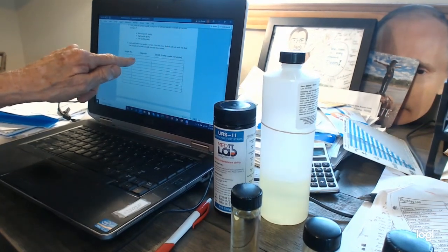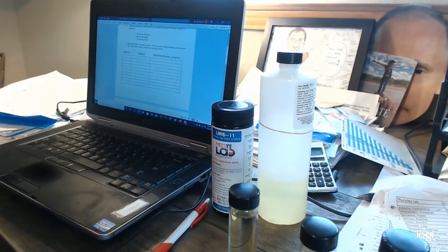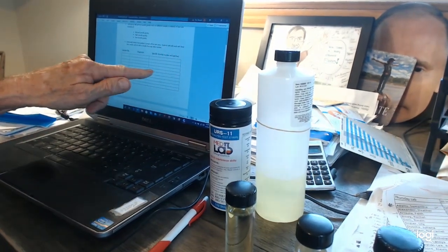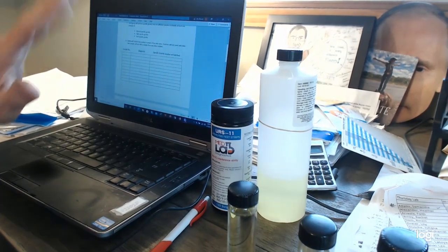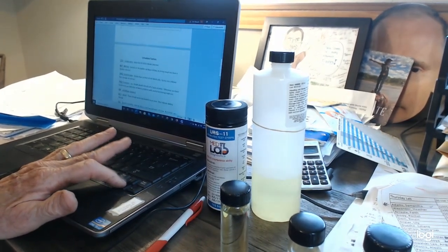The diagnosis, if it's glucosuria or glycosuria, if it's hematuria, if it's high specific gravity, if it's low pH, or something like that, then put those things in there, and take a picture of this and send it to me, and this will count as you having done this part of the lab.